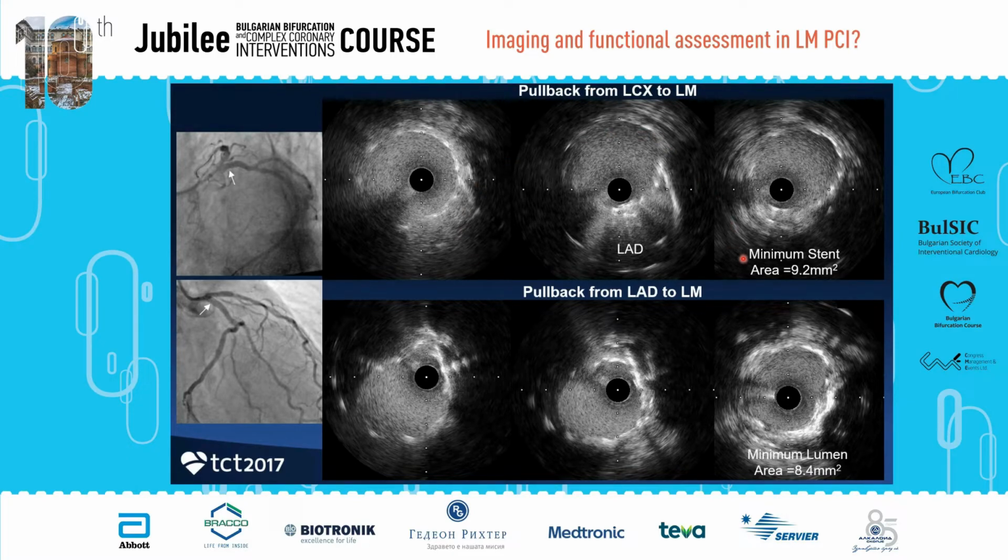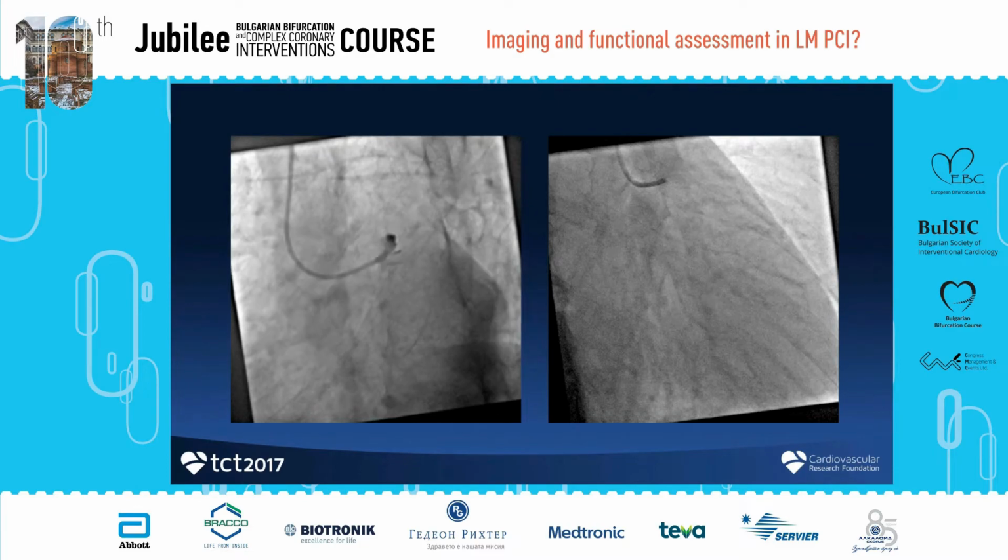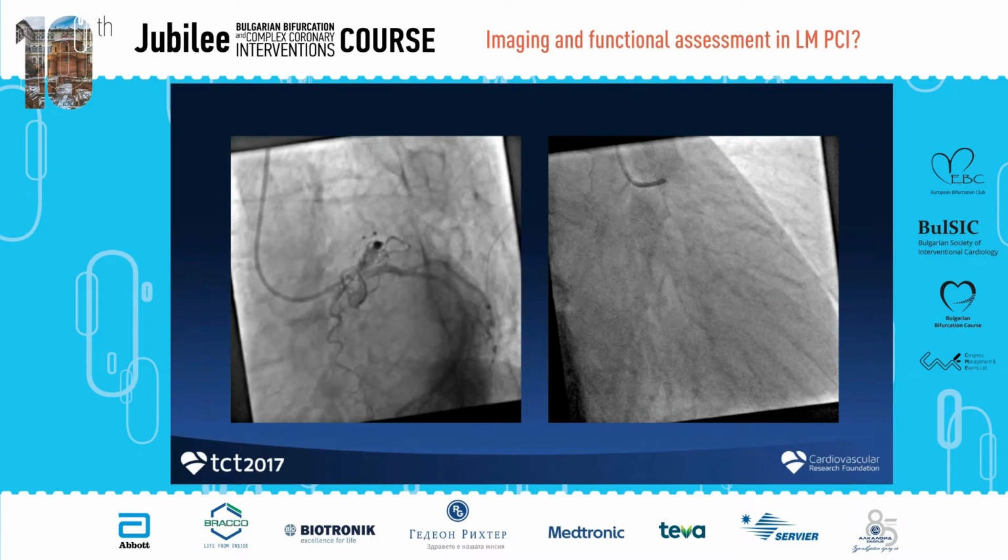But this type of phenomenon we couldn't recognize by looking at the angio only. So this is how it looks like at the end of the procedure.